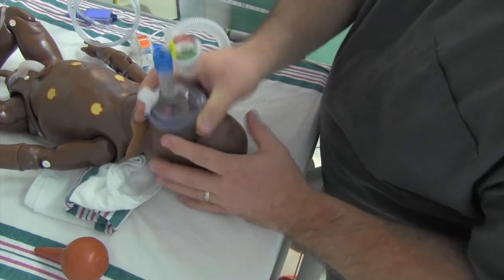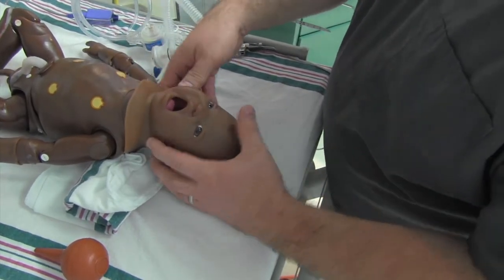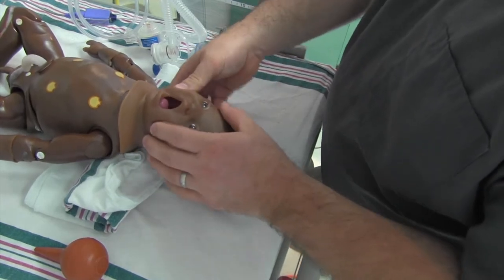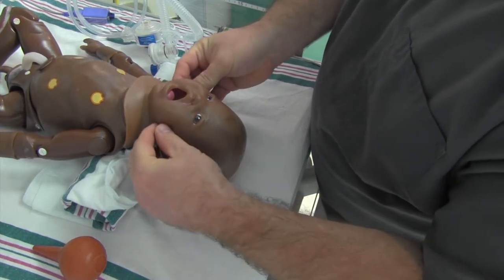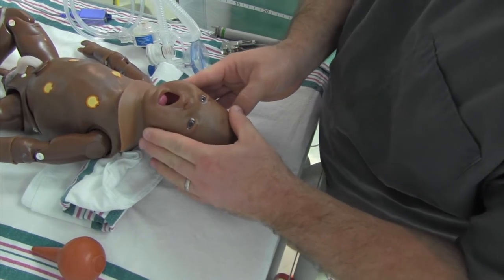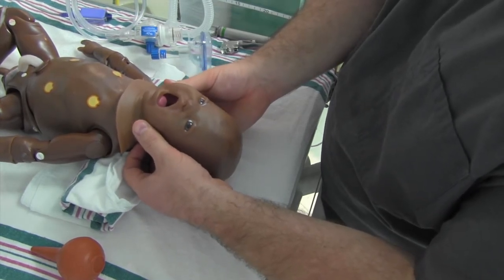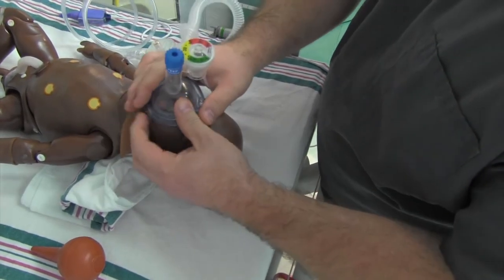I'm still not getting the pressures I need. The next one is O - open the airway. This guy's airway is really nice and open almost constantly. You kind of adjust the jaw a little bit - they got nice little jaws if you can get a hold of them. They're really cartilaginous so their jaw moves quite a bit. You can kind of move it down a little bit - you don't want to dislocate it, just put a little bit of movement on it. Maybe the tongue is stuck in a weird position or something. So O for open the airway.